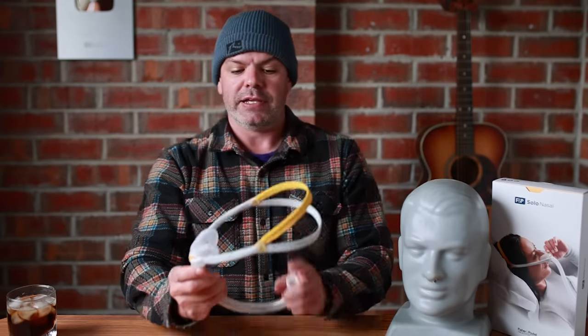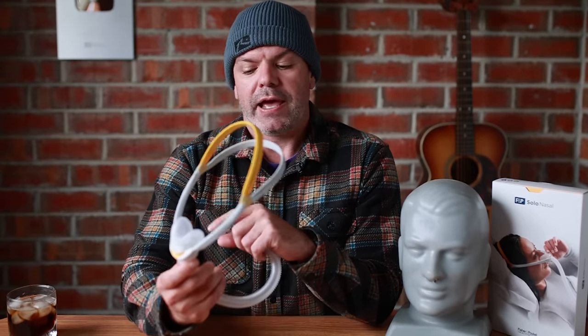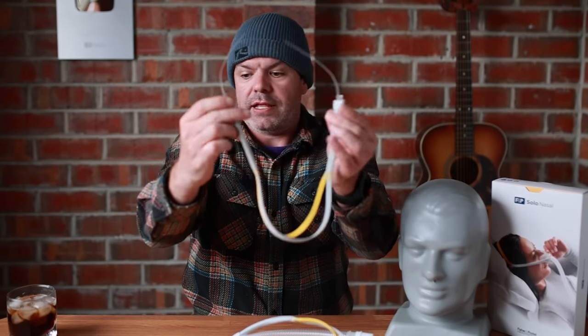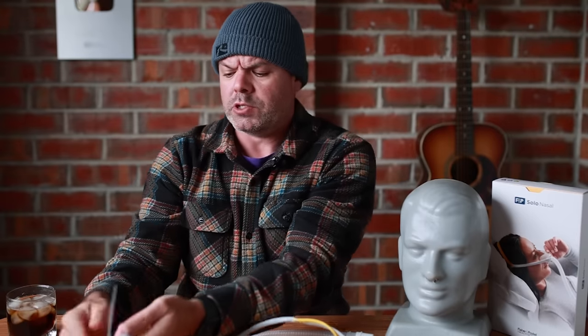And the main reason is this head strap. I've had a lot of comments from people saying, 'Nico, it's just the P10.' And today I want to show you why it's not just a P10. I've taken apart the head strap, and I want to show you how it works, because it must have taken a lot of years to develop.